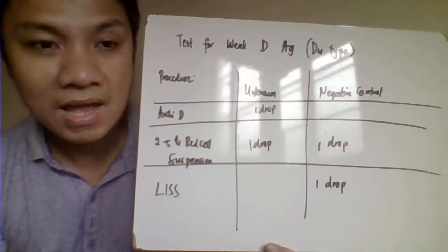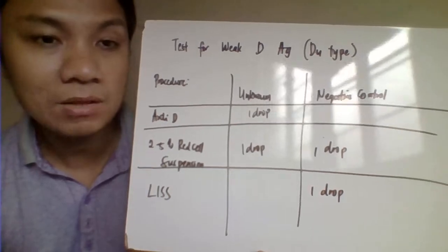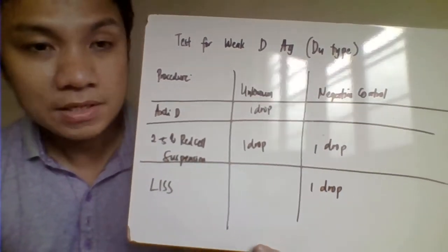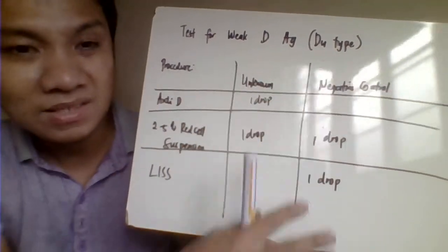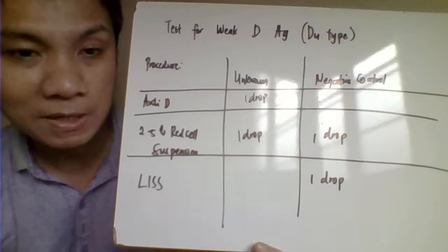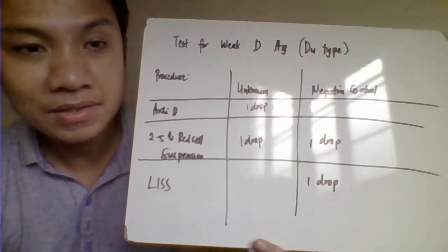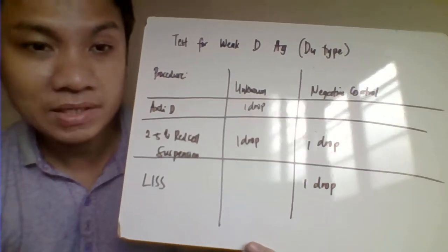Okay, and when they're tested, they still give a positive result. Only that you need to confirm that one by an indirect antiglobulin test. The procedure for identification of that is your indirect antiglobulin test. With enhancement, since your D antigen or your RH blood group system, that one is an IgG antibody.